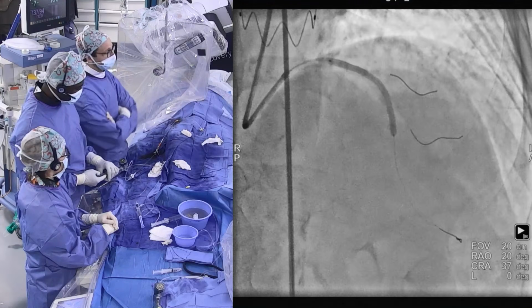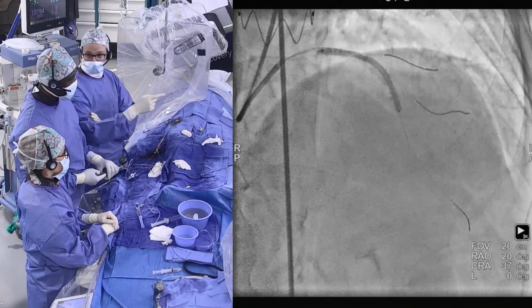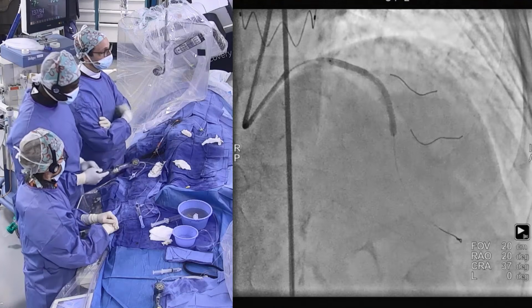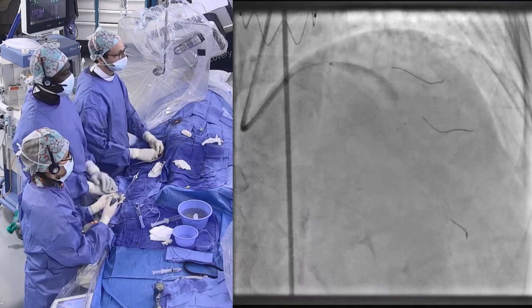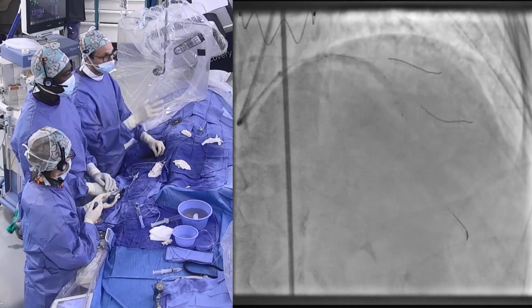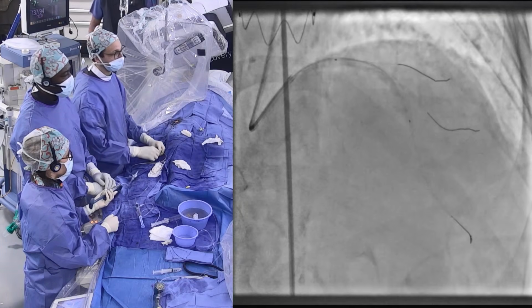In fluoroscopy, we have the impression that there is no indentation, especially on the distal part of the lesion, which was a heavily calcified and tighter part. So let's do a POT, and I think the IVUS can give us the size of the balloon. Maybe on the mid-LAD we go with a 3.5, and on the proximal part of the LAD, 4 millimeters.